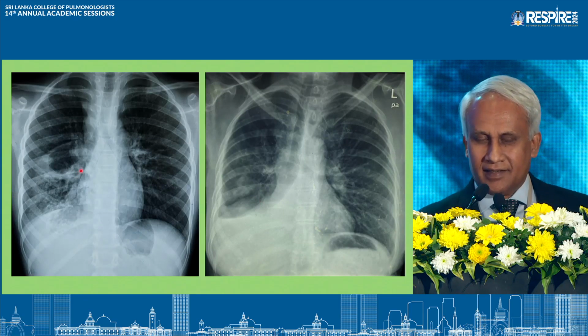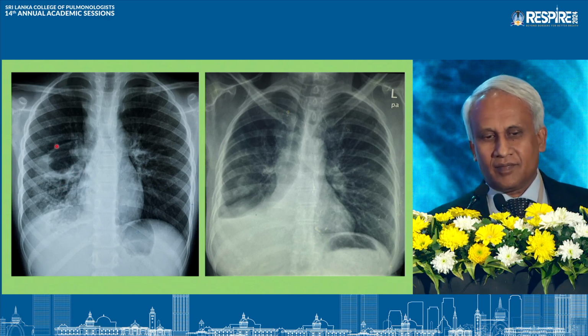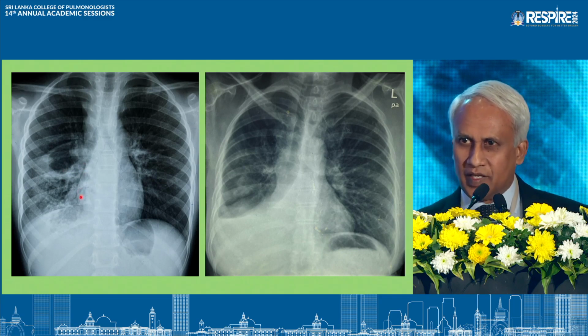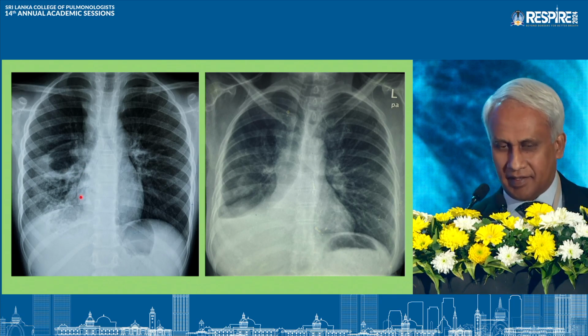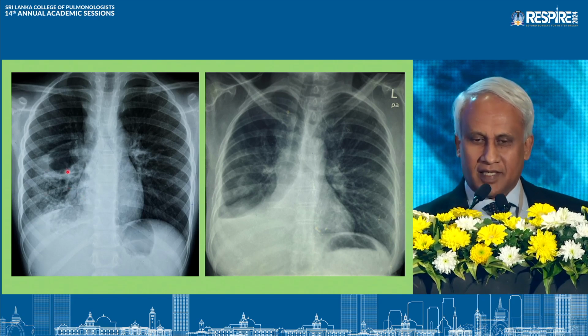In this X-ray, it's a young girl with tuberculosis, and you can see cavitating lesions, but you can nicely demonstrate the right heart border. So it should be behind the right middle lobe. It should be in the lower lobe with a cavitating lesion in the apical segment.